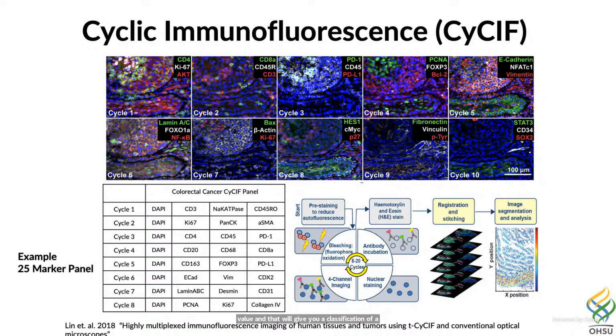This is a really powerful approach to investigating the tumor microenvironment, and has a lot of potential applications for improving our ability to perform diagnosis in a pathology setting. But unfortunately, there are limitations that we have to address.